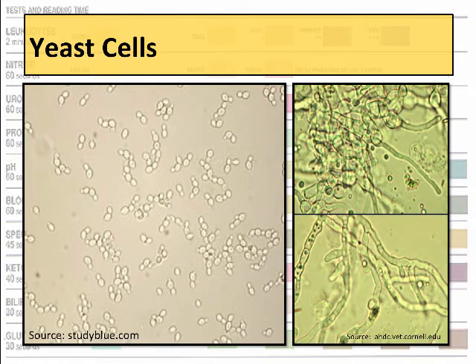Yeast cells are tricky, and that is because they look very similar to red blood cells. One of the nice things is they're generally, and this is a very pixelated image, but generally they are more oval. And one of the key features that you'll see on a yeast cell that's different from a red blood cell is that they oftentimes are budding, and that's basically their form of asexual reproduction. They're going to have a little yeast cell budding off of a larger one, growing off of it. And you're not going to see that in red blood cells most of the time.